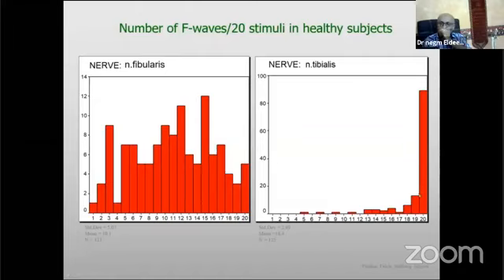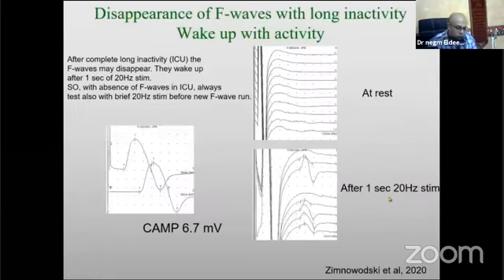That is because we have responses from each of the small intrinsic foot muscles. We do the study with the patient at rest. We do not activate at all. To have the situation at rest is the most standardized.